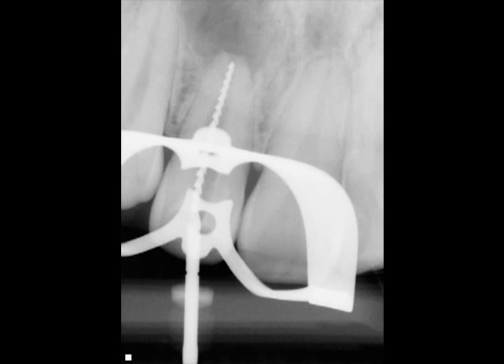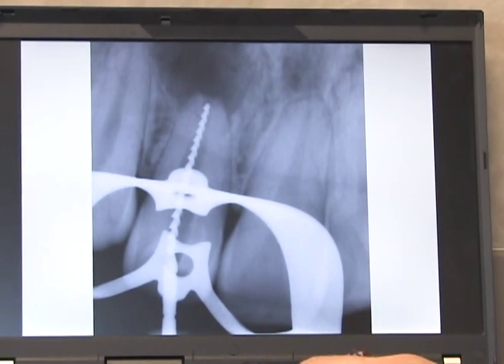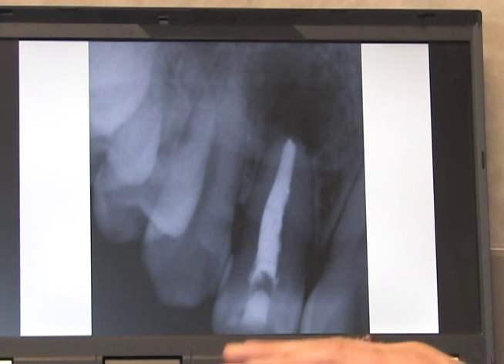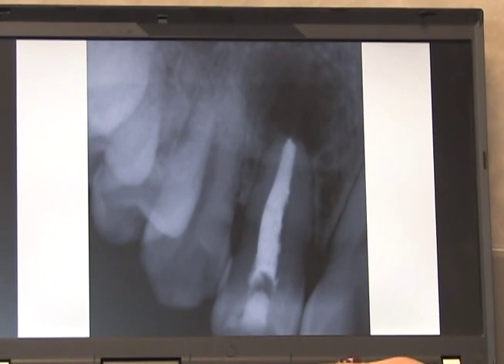We went ahead and did a working length picture. You can see the extent of that radiolucency — it's very large. This is the final picture. We're going to have him on recall. You can see all that dens invaginatus is pretty much cleaned out. It looks good.